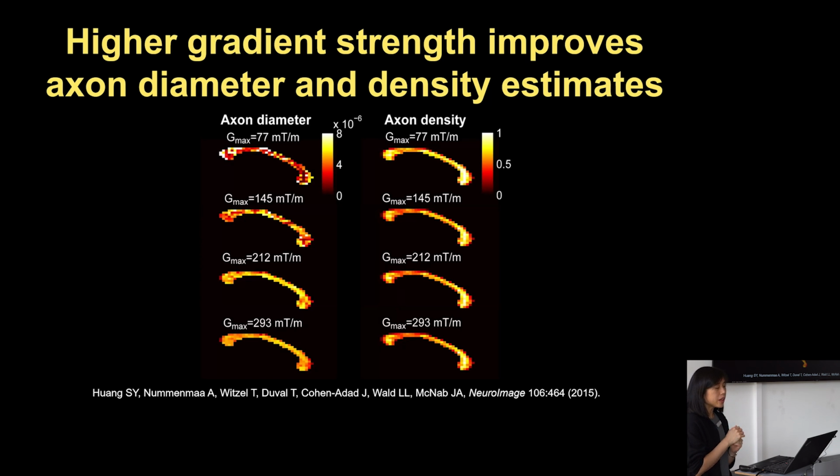We've also used it for high resolution diffusion imaging, diffusion tractography. But I think one of the important contributions that the Connectome instrument allowed us to demonstrate was that these dedicated high performance gradients can help us acquire a rich array of diffusion microscopic measurements that really get down to the neural tissue microstructure. And one of the key applications that we were able to demonstrate fairly early on was how these strong gradients could be used for axonal diameter mapping.